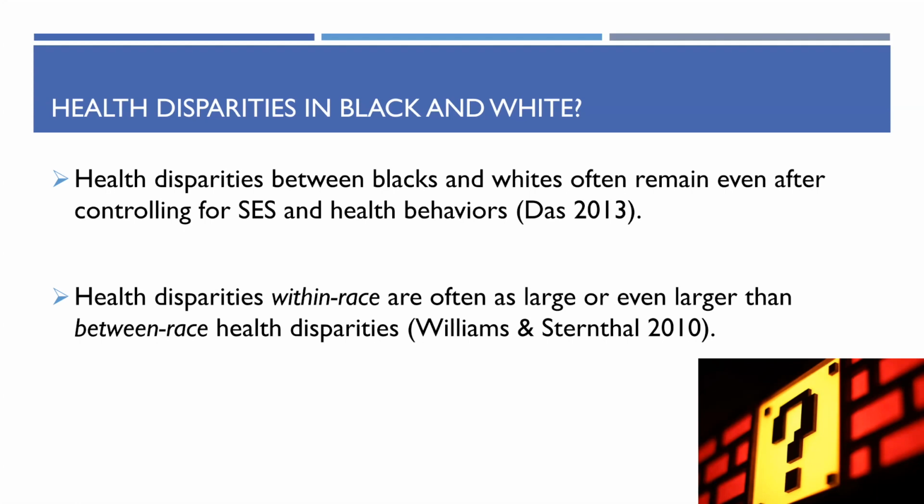And furthermore, there are a lot of suggestions in the literature that these disparities may actually even be larger within race. Which is to say that there may be perfusion differences within race associated with all sorts of other factors that are also important to take into account when you're designing a study.